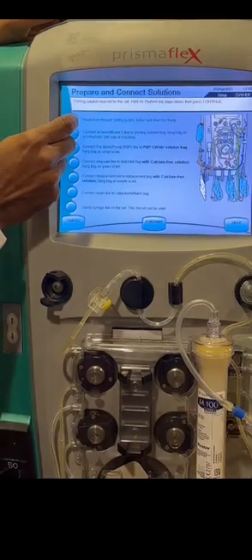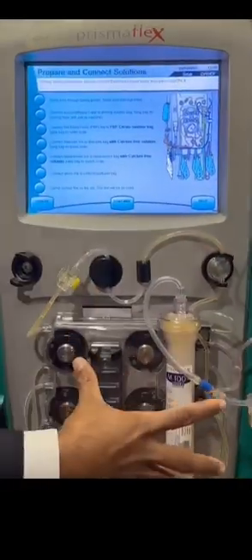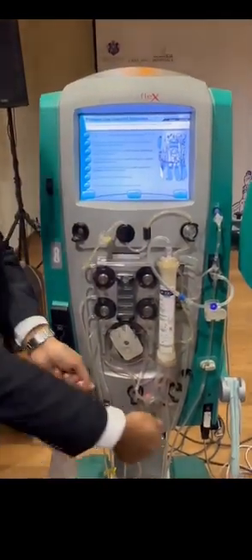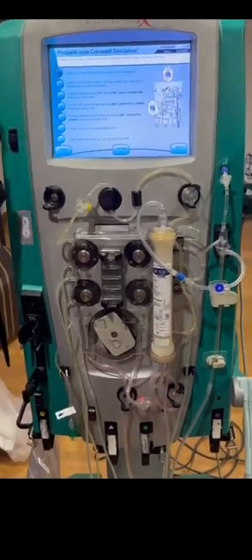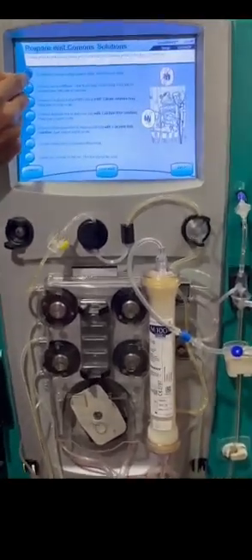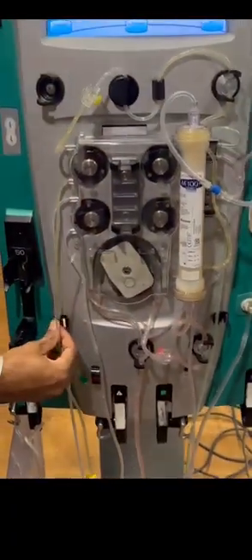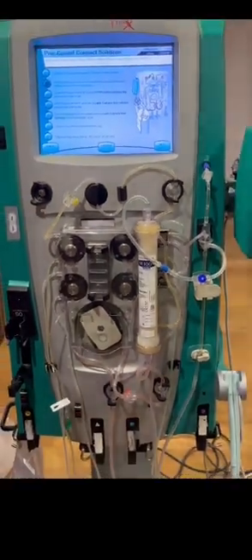Then next, we will prepare and connect solutions. We have connected the filter, then prepare and connect solutions means the priming solution as well as the dialysate and replacements. So here also we have steps. What it's saying first: if you need, you can just keep it here for securing this. Then second is connect priming solution.